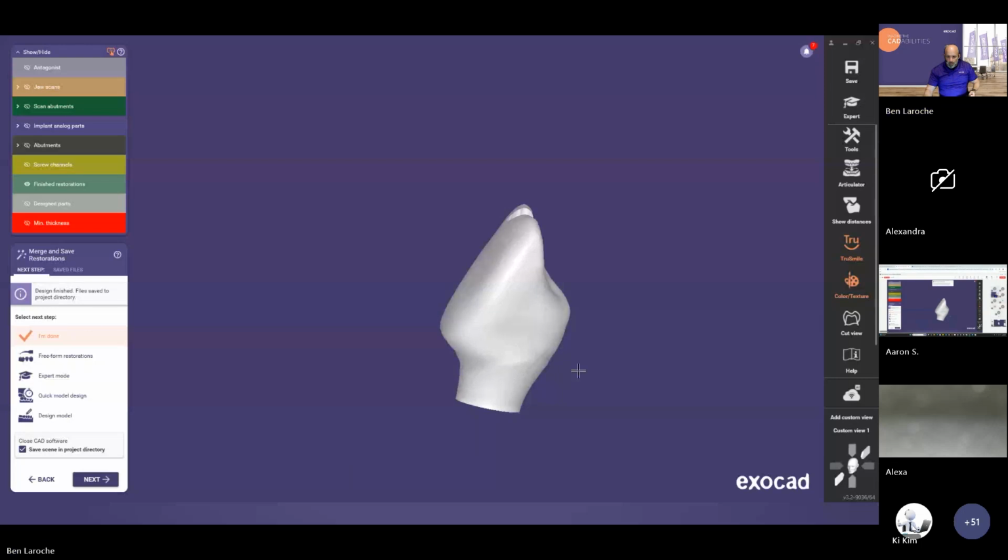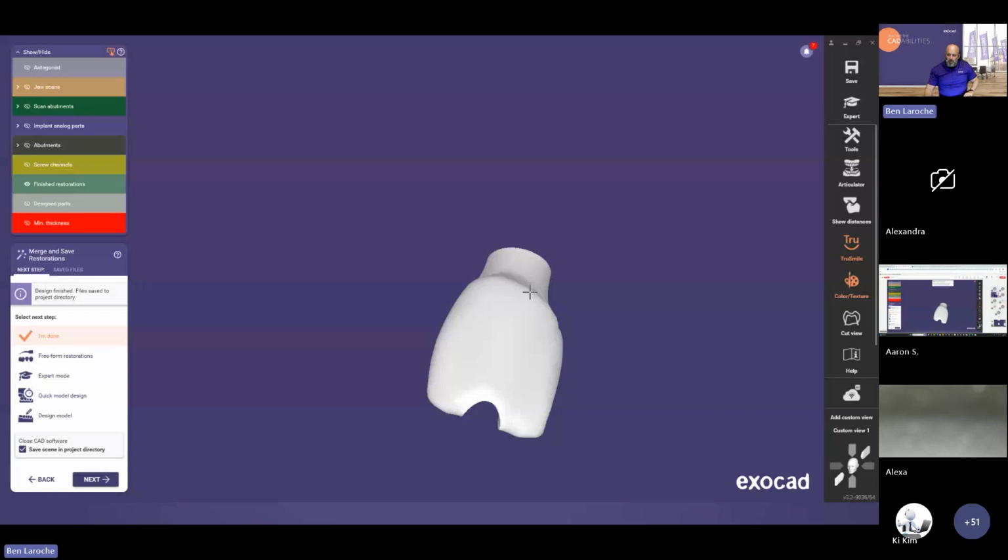Unless you guys wanted me to go over anything specific before I go on with the rest of the PowerPoint. So I'll leave a couple of minutes here to see if there are any questions on the design portion that I can go over.